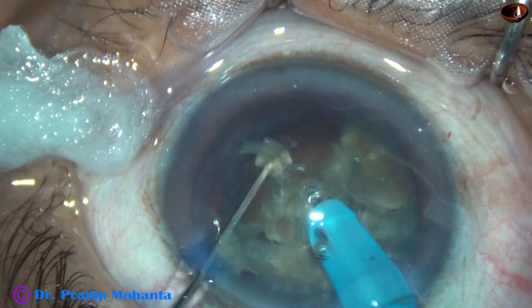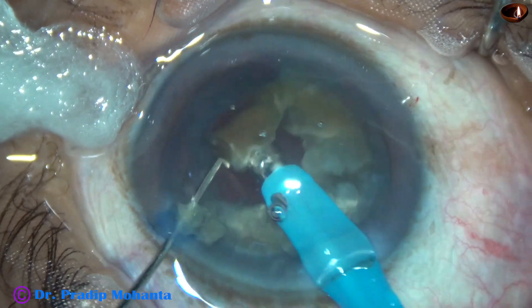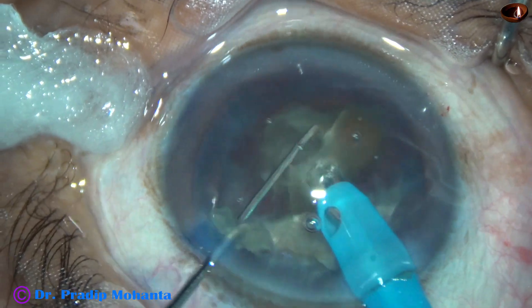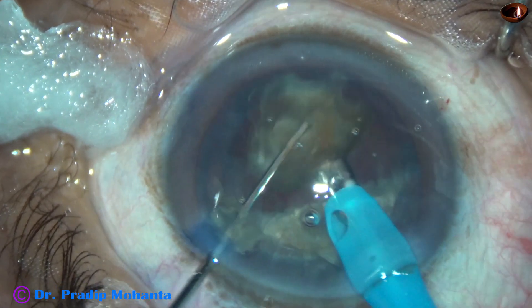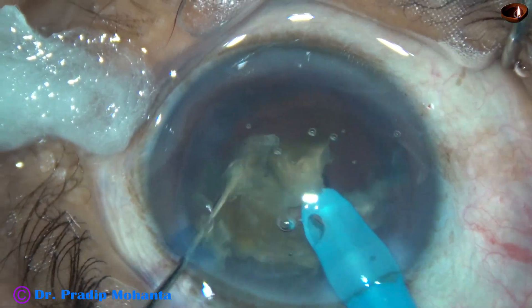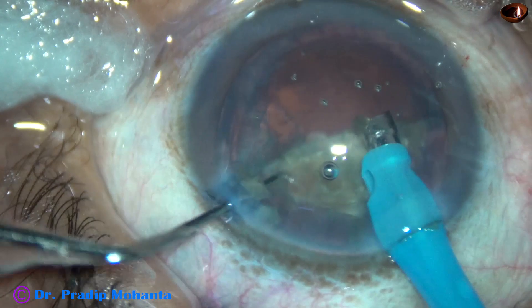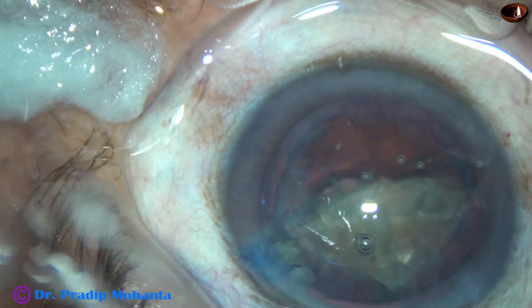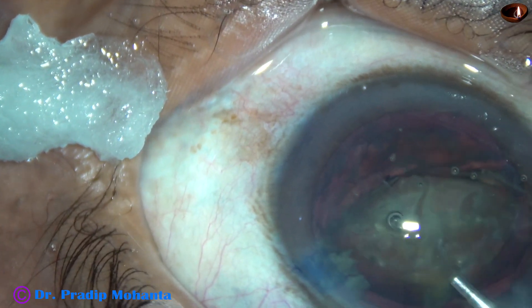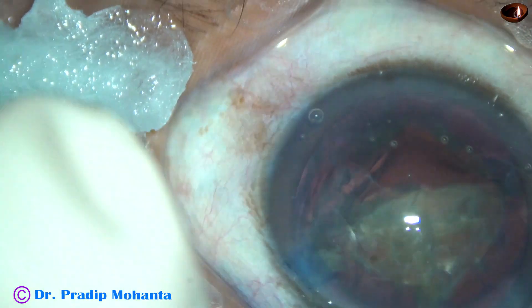This is a very nice technique for high-volume surgeons who want to save time. It is also very safe. The thickness of the nucleus is about 4.5 mm and you are going hardly up to 3 mm. There is no chance that when traveling through the substance of the nucleus you will catch the posterior capsule. To protect the corneal endothelium, I have come out and injected visco.